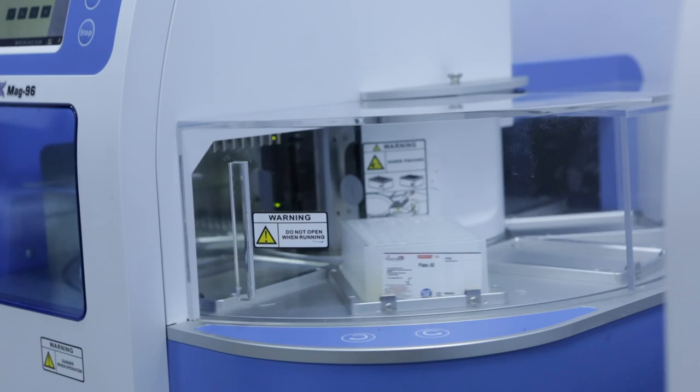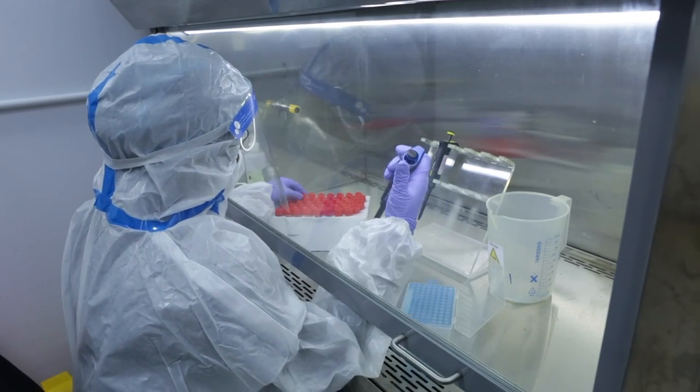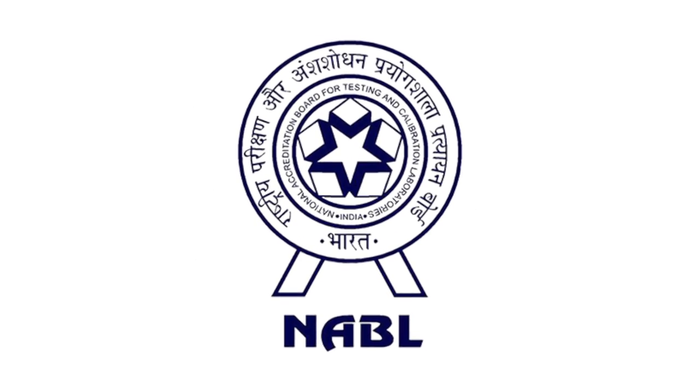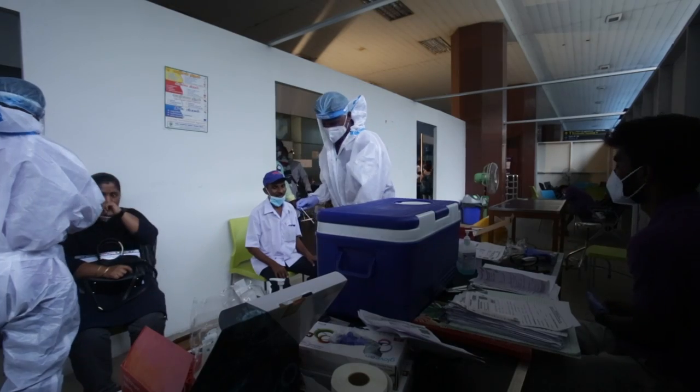This is the state-of-the-art facility for RT-PCR testing of COVID-19 for inbound and outbound passengers. The lab is approved by the State Health Authority, ICMR, and is accredited by NABL. Passengers traveling from various nations are tested here once they arrive. The idea is when passengers are coming, we have to take their sample and their registration is done so that if anybody is found positive, the same can be conveyed to them and the government of Tamil Nadu for taking the further action of tracing and testing and then taking care of the concerned person.